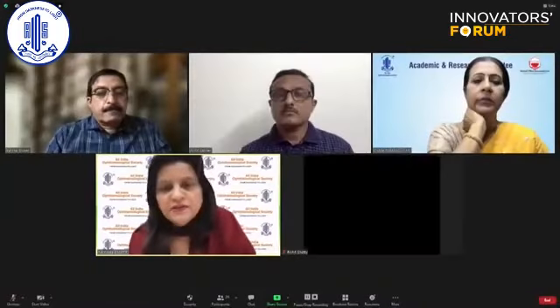Thank you very much, Dr. Alay Banker. Did I see correctly? Some of the pictures were actually better than the actual pictures. Some photographs were sharper on the smartphone than on the actual camera.